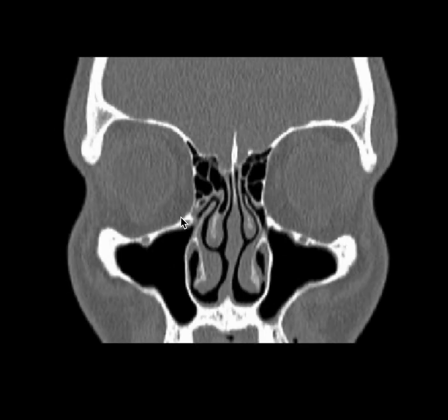This is your osteomeatal complex. We start seeing the middle turbinate. The middle turbinate on the left side is smaller than the right side, so possibly there was a big spur over here which was impinging and did not allow the middle turbinate to come down or increase in size — it blocked its development.